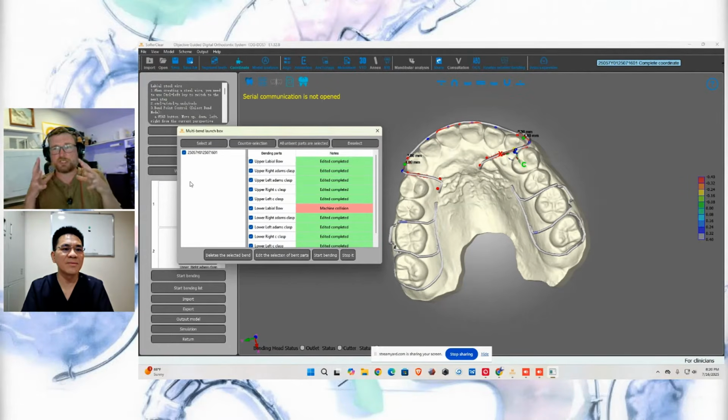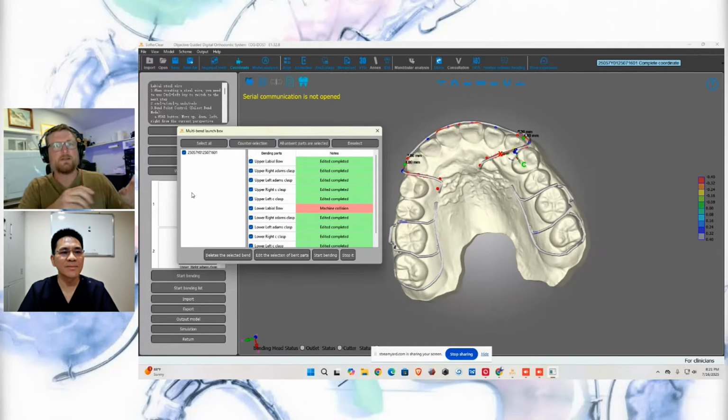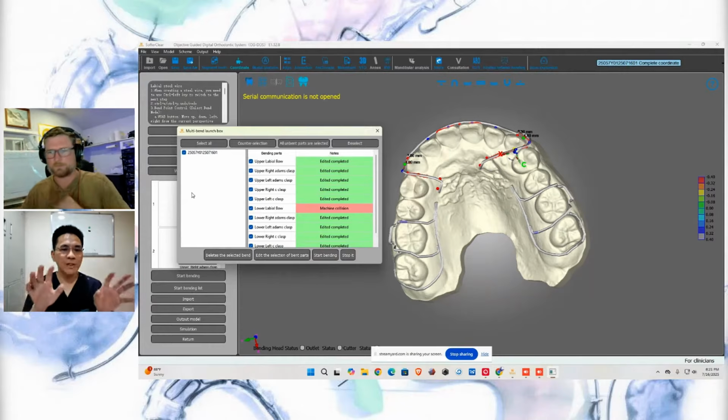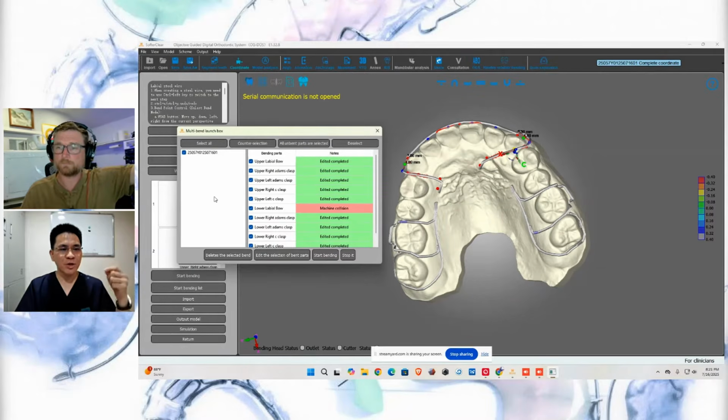Okay. So if it's just me, I don't have that; that's for bigger labs. Yes. Okay. Labs that want to have a separate designer, but they're all bending on one machine. And you said, I think, like 5 digital designers, and they all send it over. Yeah. If 5 digital designers, they also don't do this job. If the person has another machine, they design the wires and send the 3D wires for you.